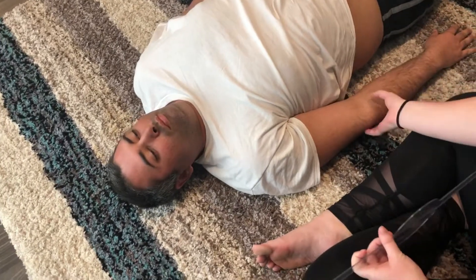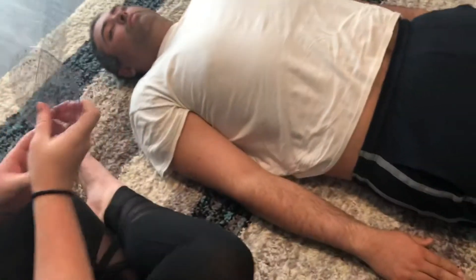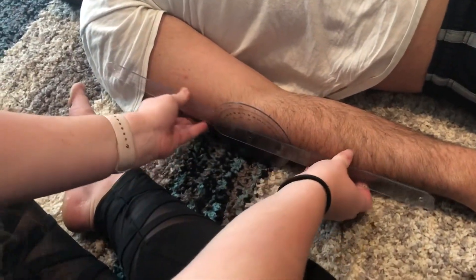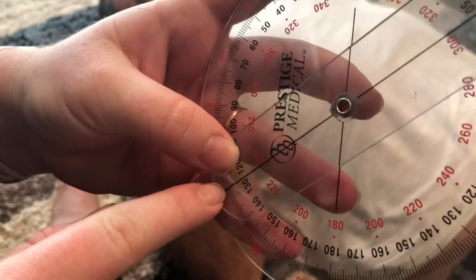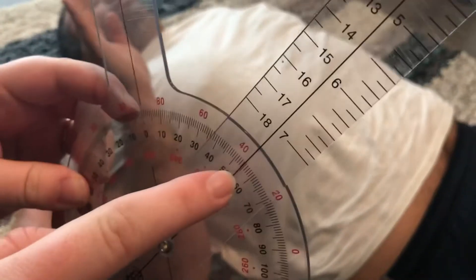We're gonna go ahead and do your elbow. Same thing — just lift it straight up as far as you can, and once you start struggling, that's when I want you to stop. I'm gonna be right here at his elbow joint. Go ahead and when you're ready, start lifting. He was about 55 degrees right there.